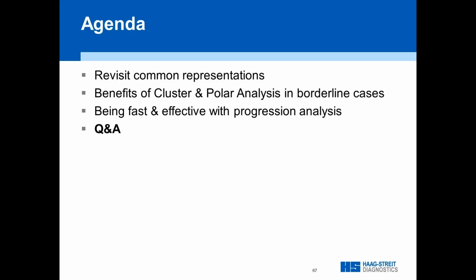According to EyeSuite, how do you classify severity of glaucoma? We don't really. There have been a couple of published rating systems out there. Most of them are based on or include MD, SLV, or PSD. Some of them include some other indicators. We don't have an output for that because there's no consensus on which one is really superior to the other.